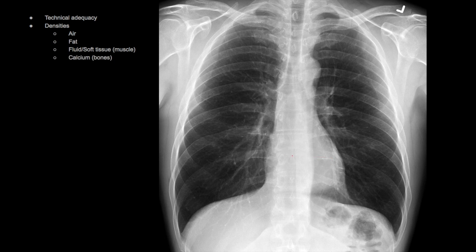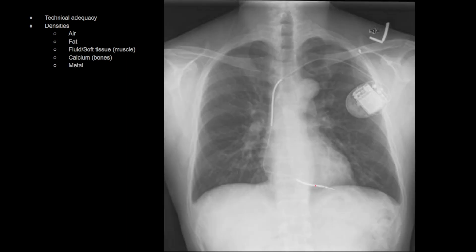The next highest density on our radiograph is going to be calcium, or bones — our osseous structures, such as these ribs. We did talk about the inspirational component of counting the posterior ribs and wanting proper adequate inspiration. The highest density you're going to see on a conventional radiograph is going to be metal. In this case, we have an example of an implantable cardioverter defibrillator with a lead going into — can you tell me what this is projecting over? That's the right ventricle. This lead overlays the left subclavian, the SVC, going past the right atrium and into the right ventricle.